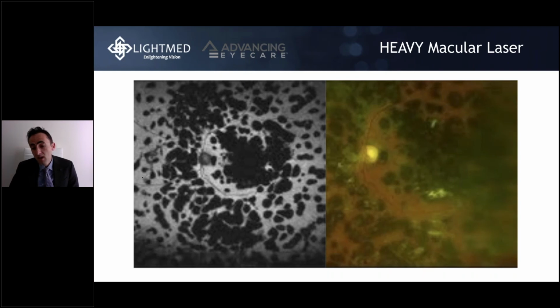It looks like from the literature they found some fundus autofluorescence changes, which are microscopic changes on a specific type of picture after the treatment when you use the 15% duty cycle. So when I saw that, I was like, I will try the 5 and 7.5%. I've not had any problems or complications with it. So for the time being, I like my settings. If I have a patient with significant macular edema that I know is not going to respond, I might go up to the 15% duty cycle. I have no problem with that, but there has to be a very legitimate reason for me to go up to the 15%.